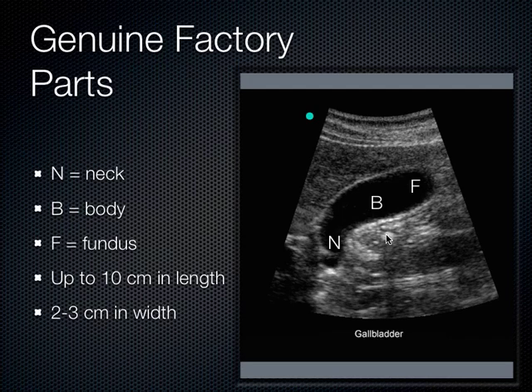And so, when you're looking directly at the gallbladder, as you get to the edge, as you're fanning through any organ, as you start to get to the organ next door, some of that sound starts to get into the organ next door to it, and it overlays that organ on top of the organ you think you're looking at. That's why some people can easily mistake it: if they get up to the edge of the gallbladder, the air in the duodenum suddenly starts to look like it's superimposing over the gallbladder, and that's how a mistake can be made, and you can say, oh, there's a gallstone, when in reality it was just some air in the duodenum.